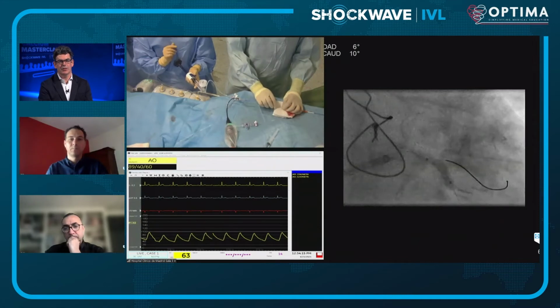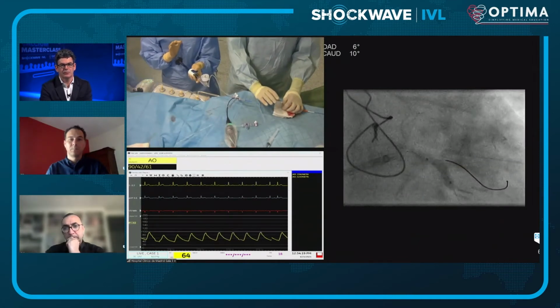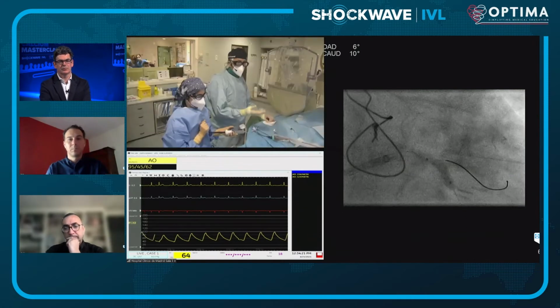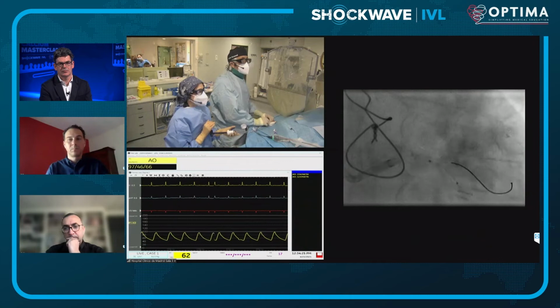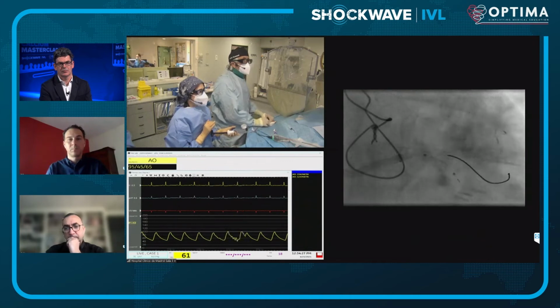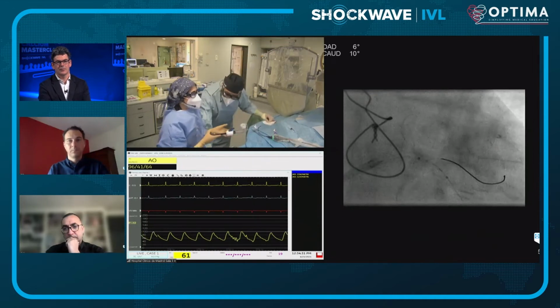So remember, it's not a conventional balloon. The function of the balloon is not the same as when you're performing a balloon angioplasty. This is very important to remember. And remember the importance also of, look at that. So you have to be careful with that.